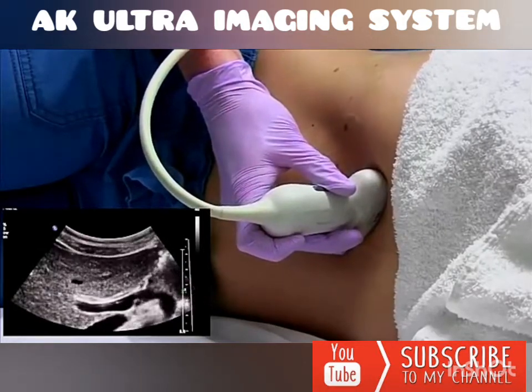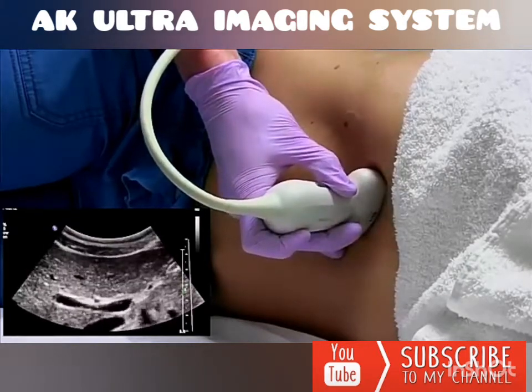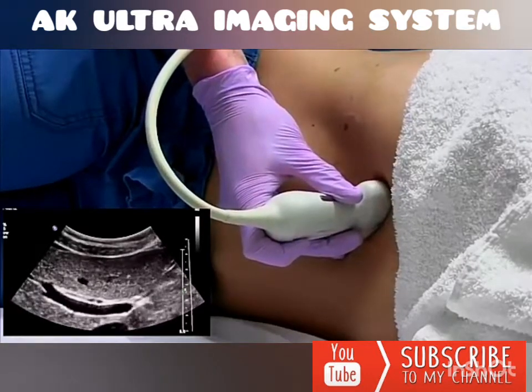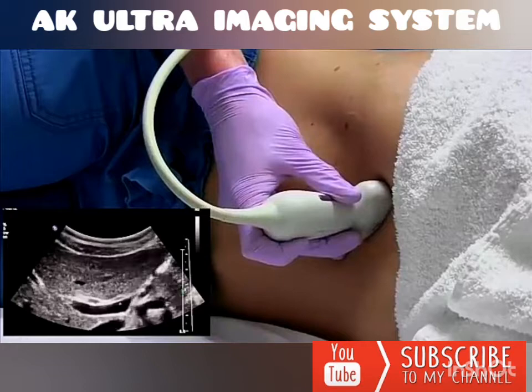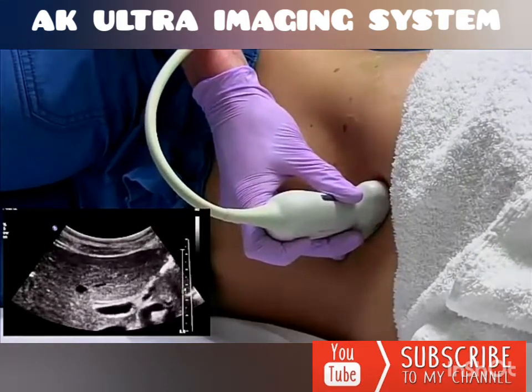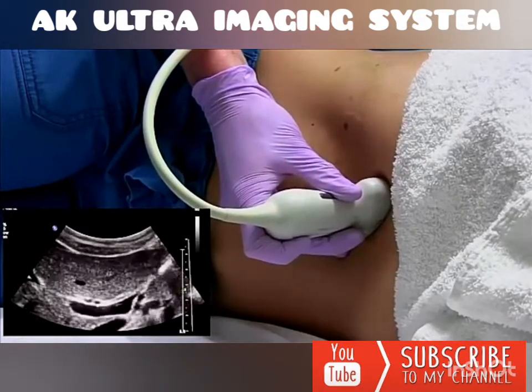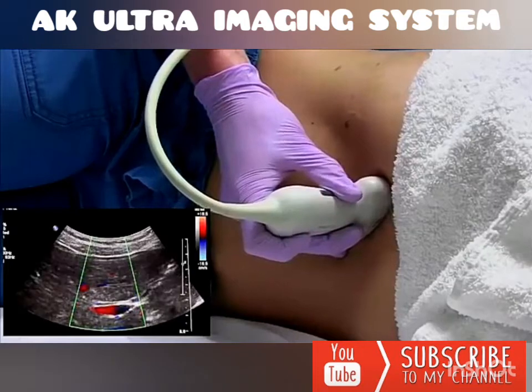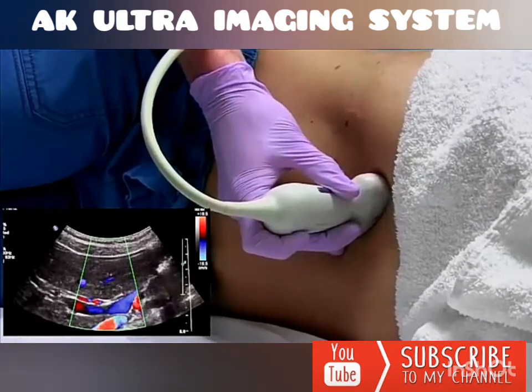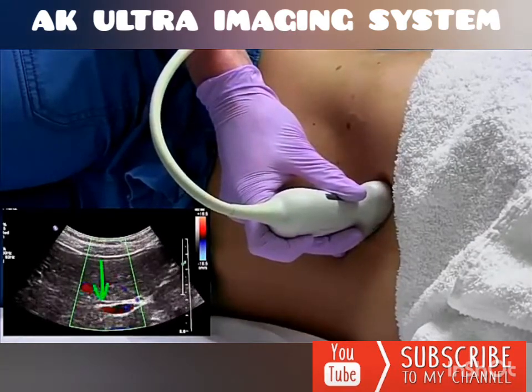So you just keep tweaking the probe until you elongate one of these tubular structures next to the main portal vein. The easiest way to see if you're on the hepatic artery or the CBD is to turn on color and see if it lights up. If it lights up, you are on the hepatic artery, and if it doesn't, that's the CBD.